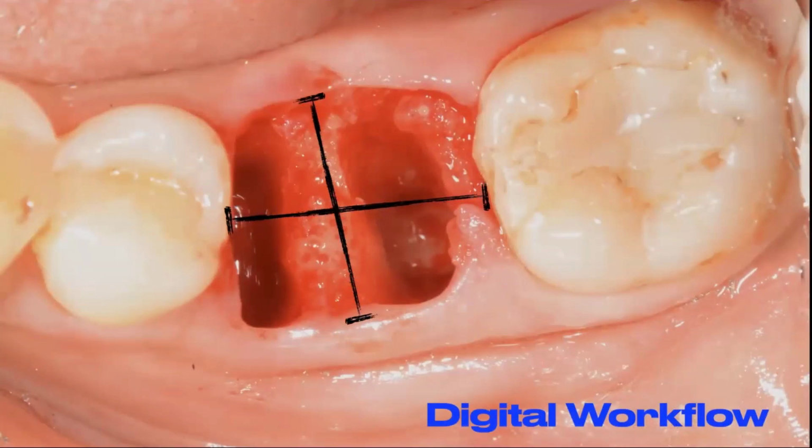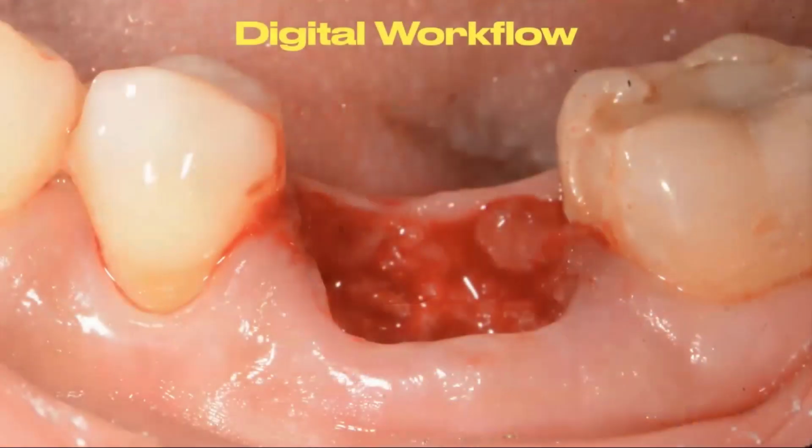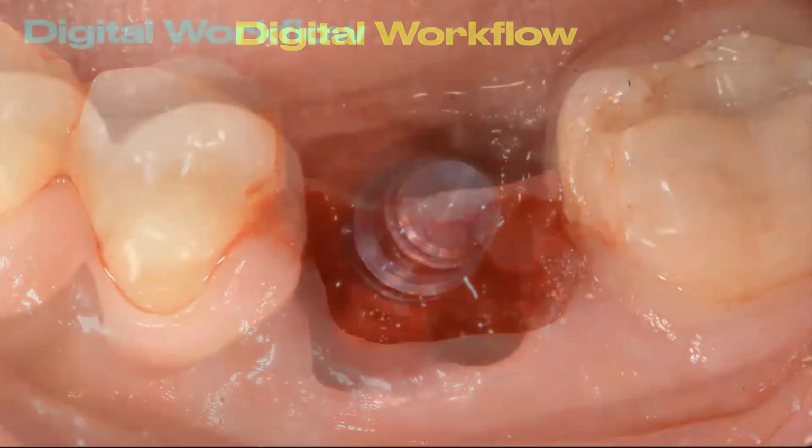In the digital workflow, in a case like this, the first thing we've got to do is an atraumatic extraction. We've got to get that tooth out without ripping it all to heck. And that's what we did here. And then bullseye, right? It's one of the hardest things to do as an immediate molar, to get an implant in the same day as a molar extraction.